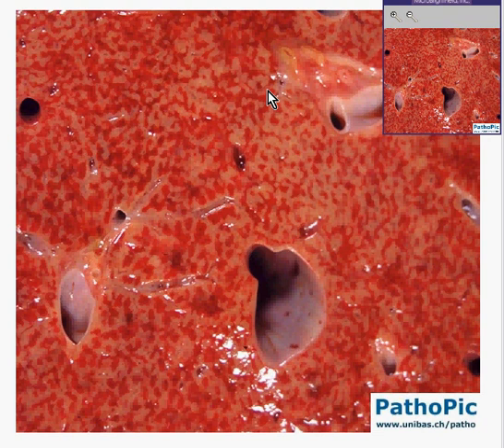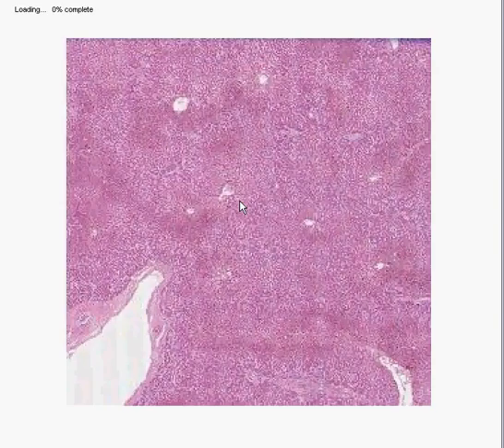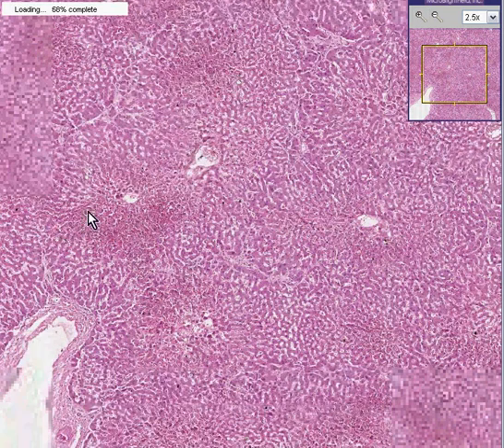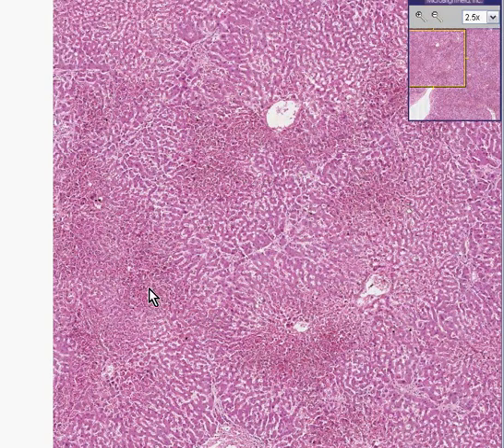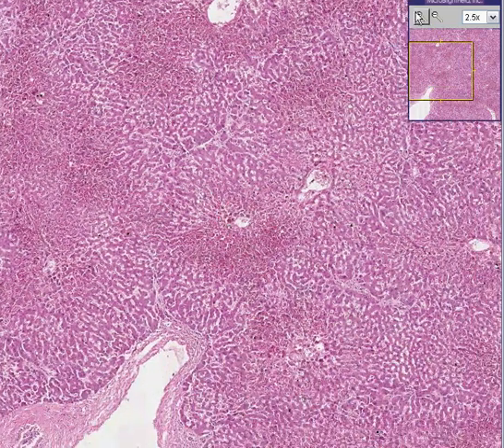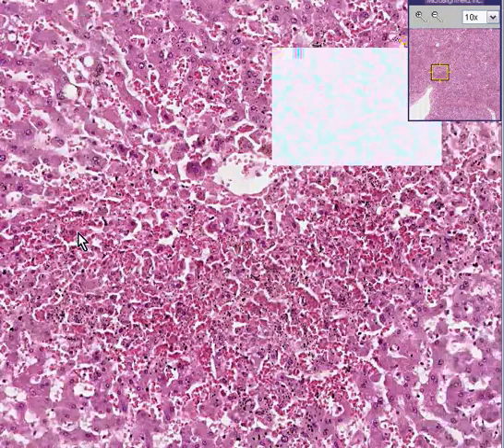Even though we're looking at the liver grossly, we are seeing microscopic lobules. If you were to look at these pinpoint or perhaps linear congested streaks microscopically, you would see that they correspond to areas in the liver — like here, like here, like here — which represent central vein areas in which you are seeing increases in stasis of blood cells.